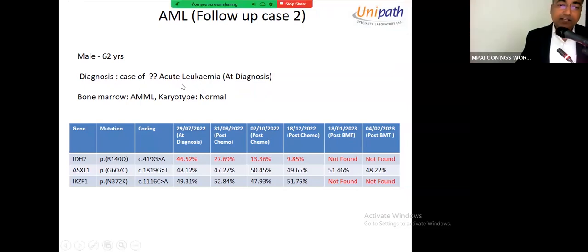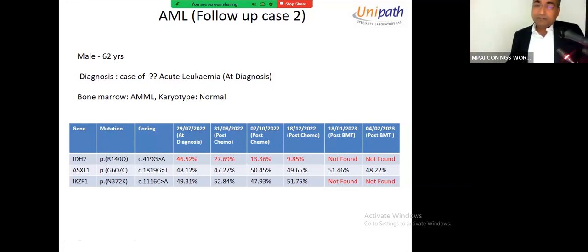You could see acute leukemia called as AMML, karyotype was normal. At diagnosis, we got three mutations, that is IDH2, ASXL1, and IKZF1. They were present at variant allele fractions of 46, 48, and 49% at diagnosis. Subsequently, this patient was post-chemo again retested, and we were not aware of that. It was a blind sample. It came and it went off. And this was the variant allele fraction that decreased. The rest two were the same. And that is in October, 2nd October.